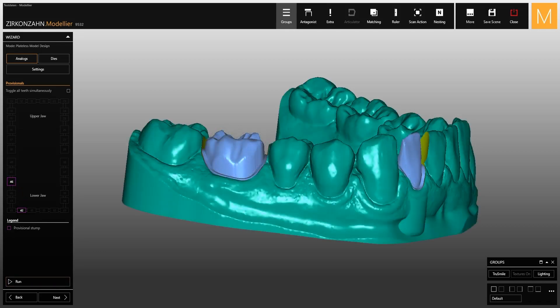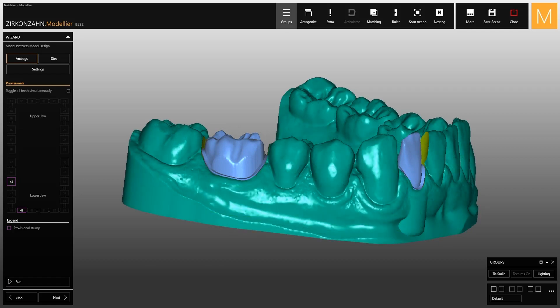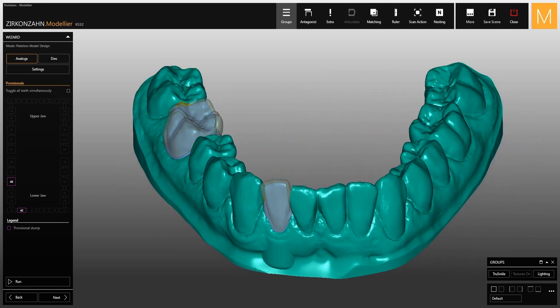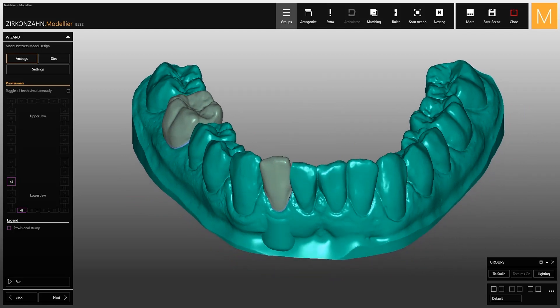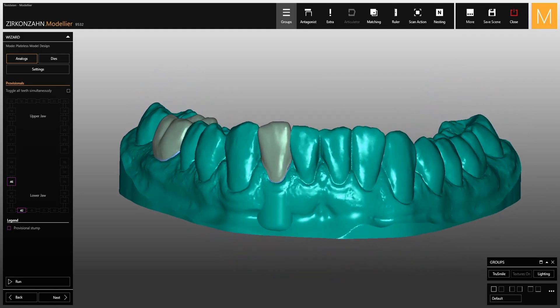When the model is created, the inner parts of the temporary crowns will be used to create the removable abutments, which you can use to try out the milled temporary crowns before handing the model to the dentist. Let's take tooth 42 as an example.